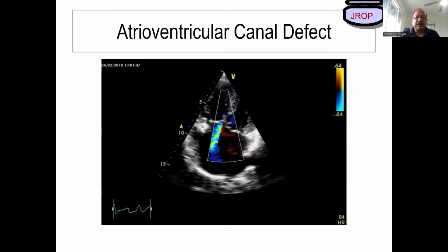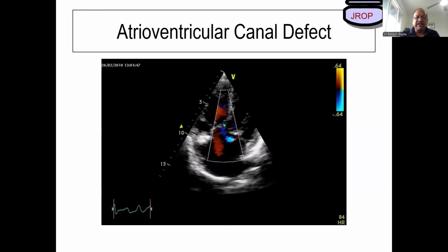Then atrioventricular canal defect, look, common AV canal defect.